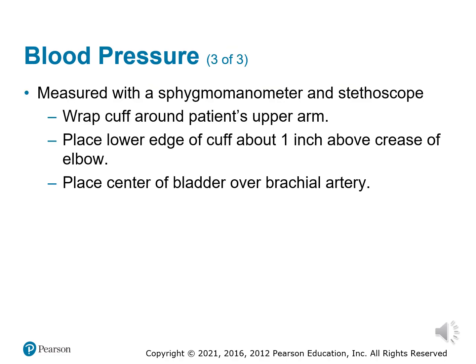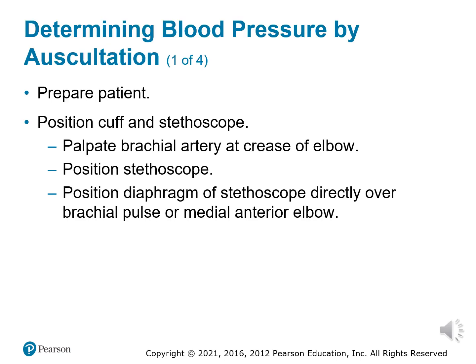Measured with a blood pressure cuff and stethoscope, you want to wrap that cuff around the patient's upper arm. Place the lower edge of the cuff about 1 inch above the crease of the elbow, and place the center of the bladder over the brachial artery.